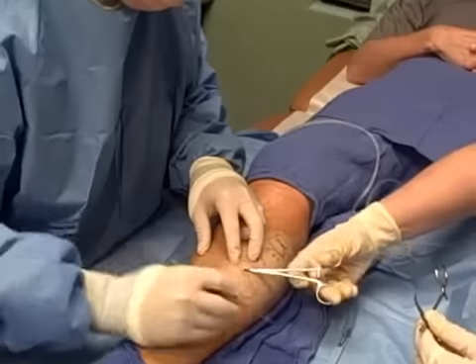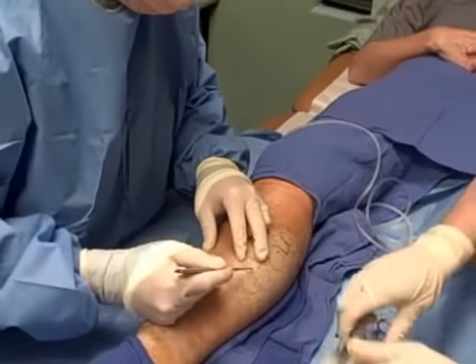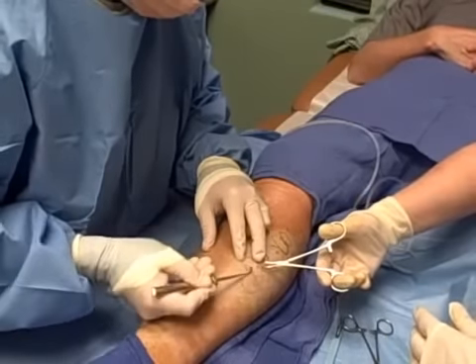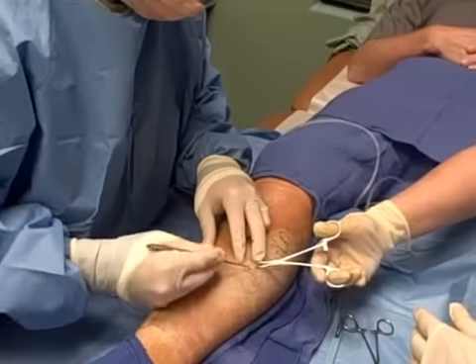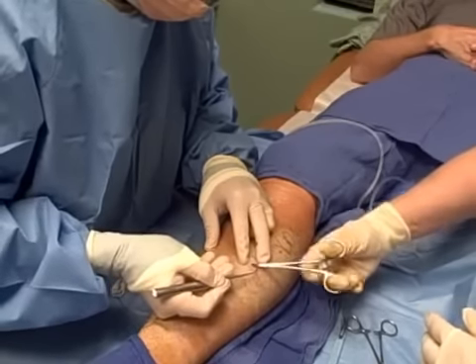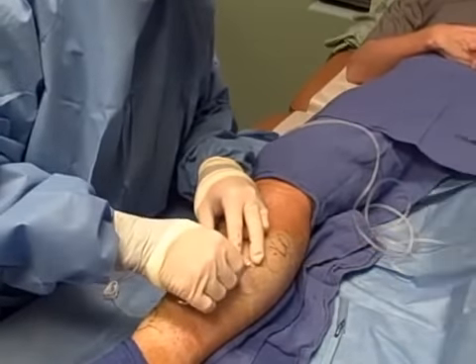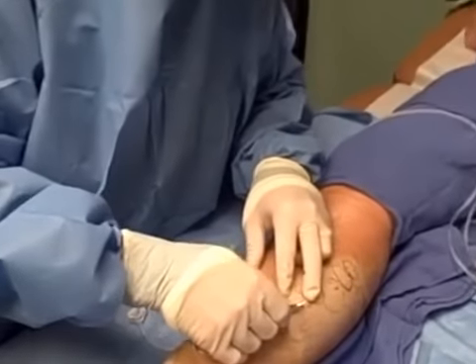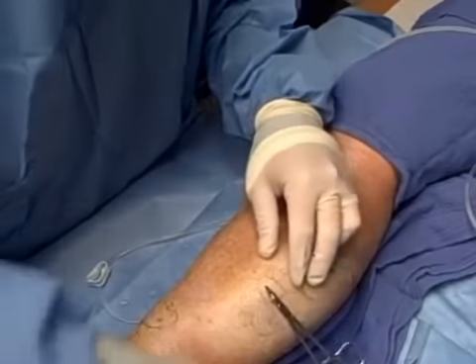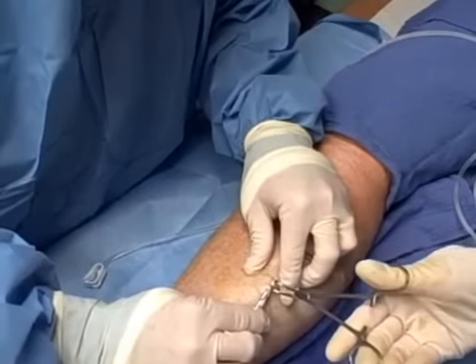We're seeing some blood there — that was a nice pickup by my assistant. Got a nice little piece there. You can see that — and then we're just going to grab it again with another hemostat. That's the vein, and we're going to just kind of pull on that a little bit.